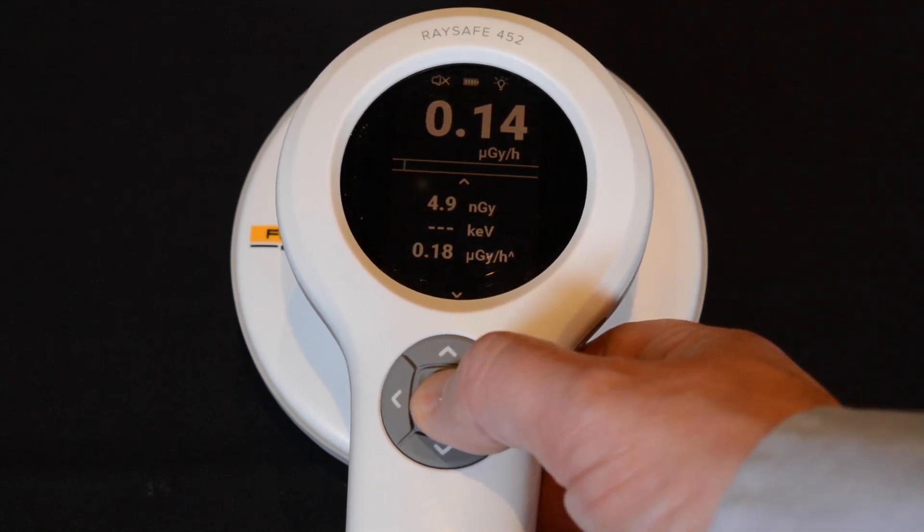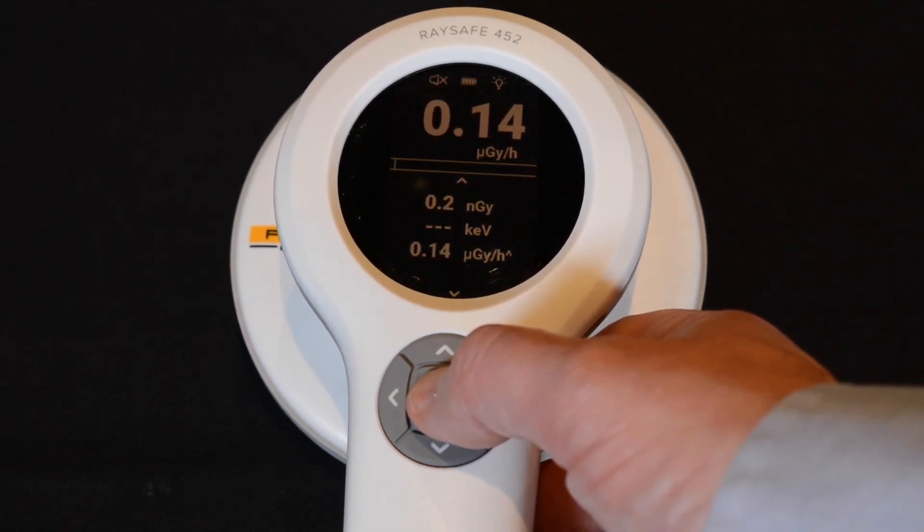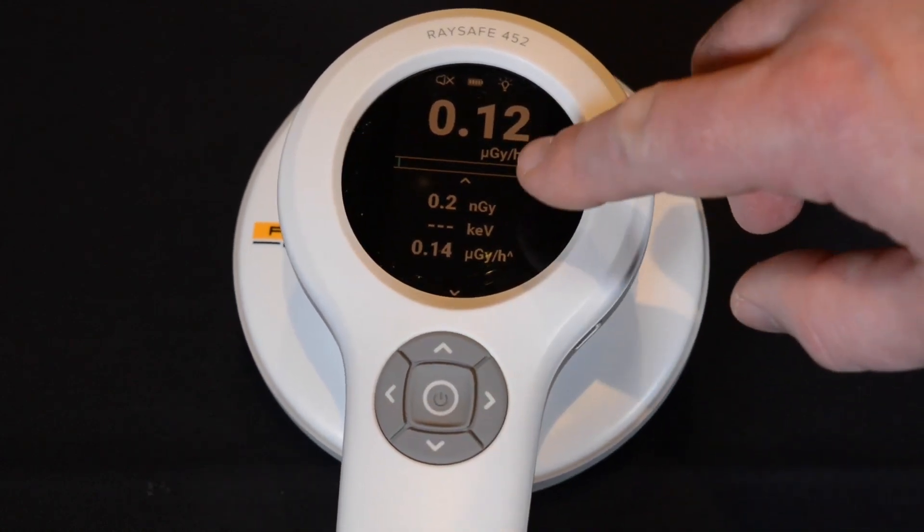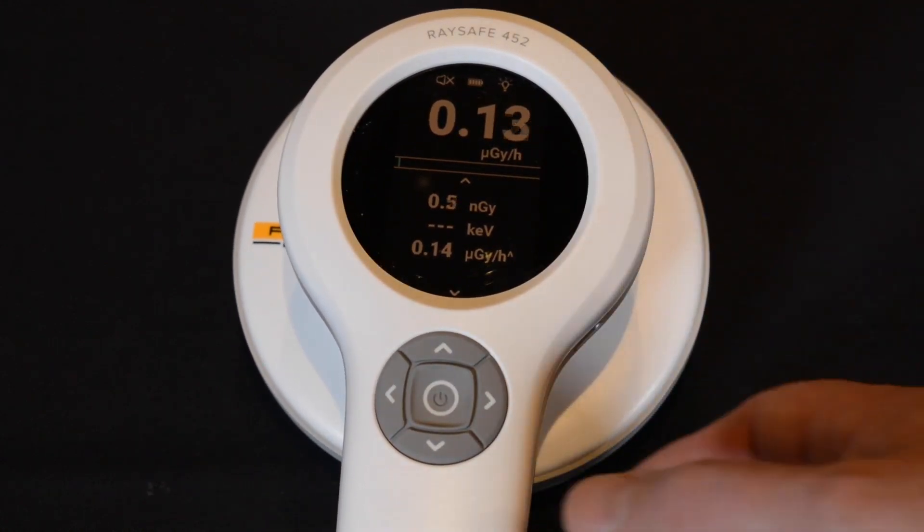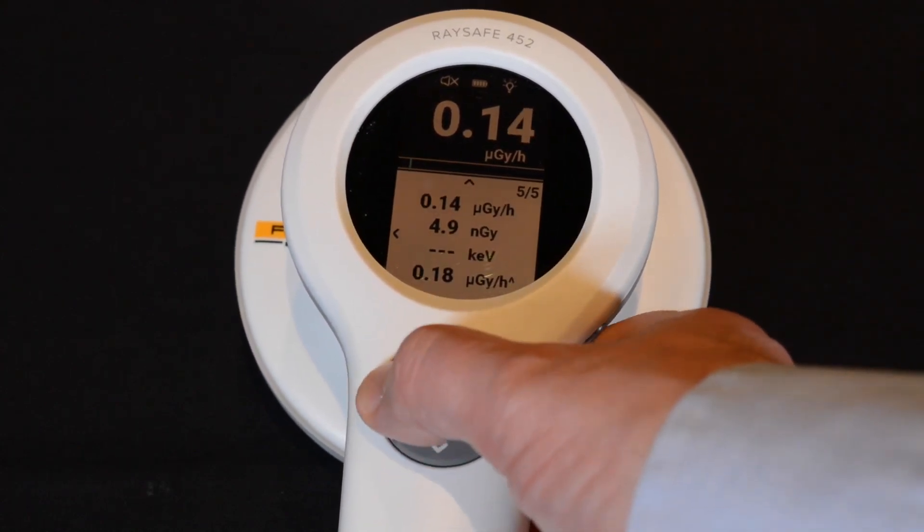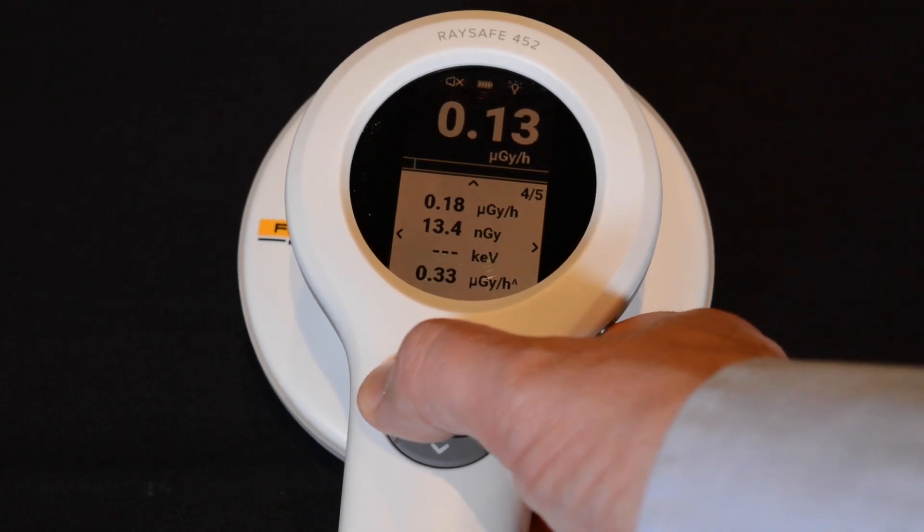You can store a measurement by quickly clicking on the center button. When you save it, it will reset the accumulation and the peak value. But the live value is always happening. You can scroll down to see what you stored, you can scroll through your saved measurements, and you can download it to a PC, export it to Excel, or handle it any way you like.